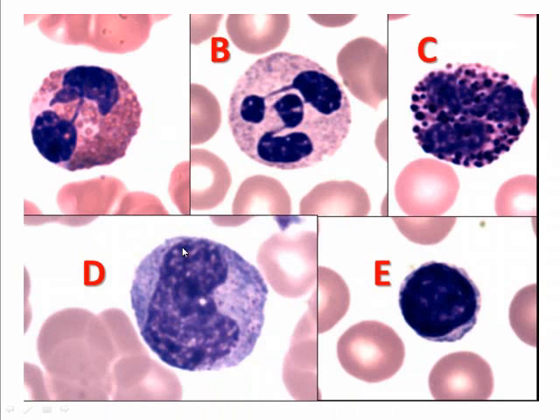So of these, what can you guess? You bet, eosinophil. Small granules, neutrophil.